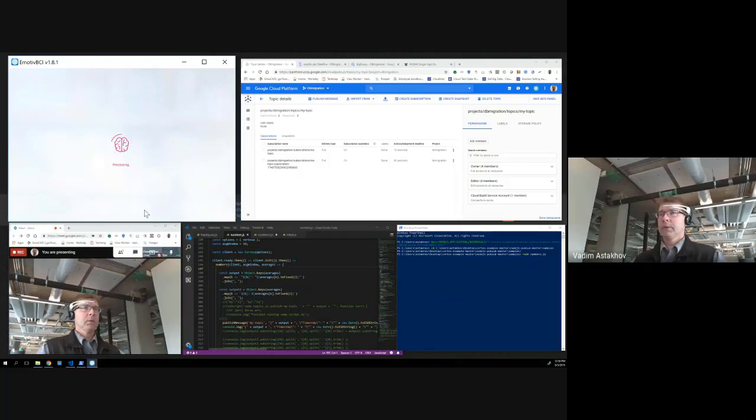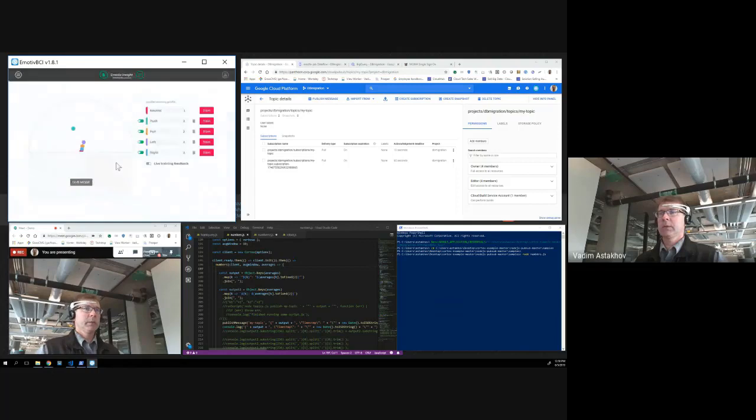So far, we're collecting the data from the device, and this interface basically shows you a graphical representation of your data. At the same time, I would like to grab that data and push it to the Pub/Sub topic in the Google platform, and then use the Pub/Sub topic as a source for my machine learning model.